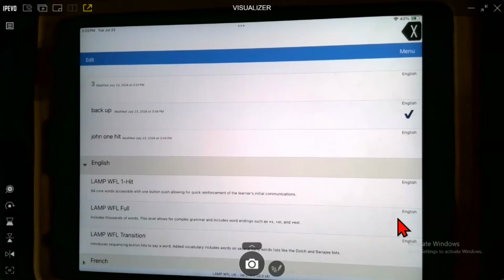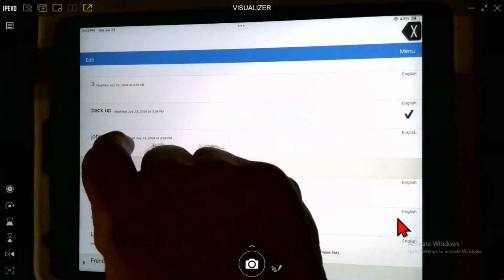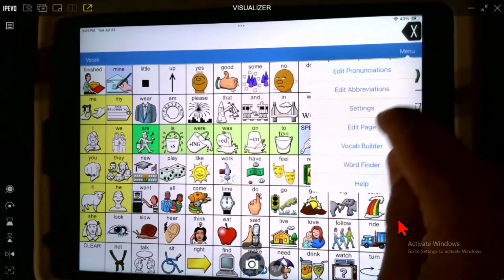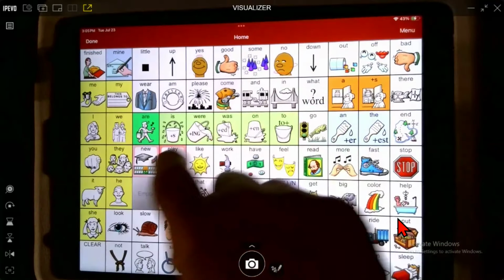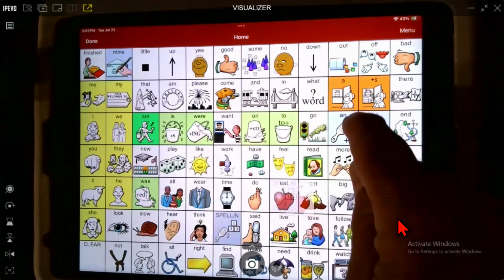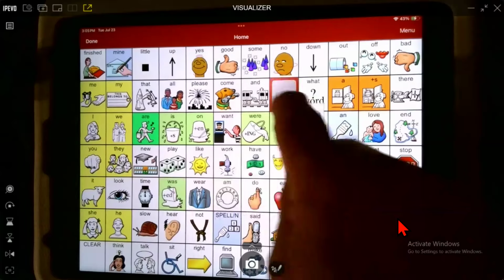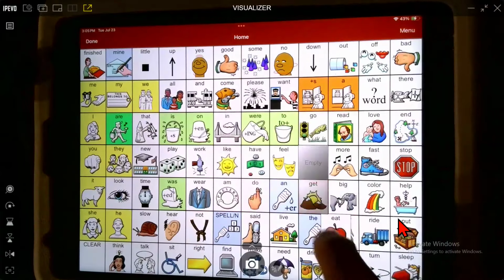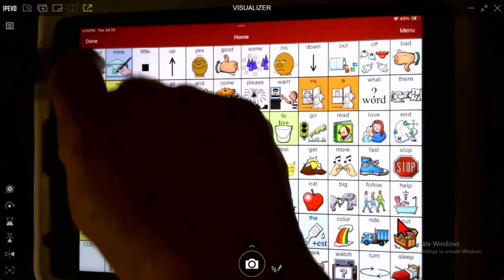Usually I'd ask you to give me the answer, but the reason you copy a kid's device is, say John hits one hit. If his best friend gets in here and hits edit page, and starts moving things around and making crazy stuff. I see this on our Facebook group once a week, and they'll say, just follow where they got them, put them back where they were. But when you get done doing all this, there's not a chance that you can figure out the combination to get that lock back to where those keys belong. So you're all stressed out.